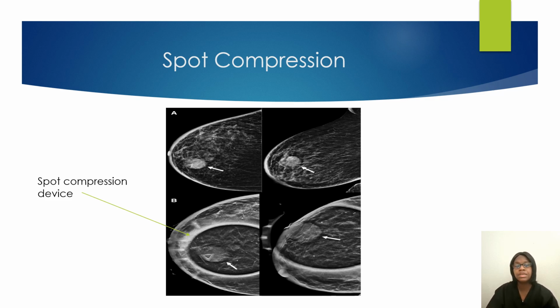Feel free to put in the comment box whether you do diagnostic mammograms or just perform screening mammograms. Depending on whether you're full-time, PRN, or maybe close to retirement, most techs may just do screening mammograms, but I know a lot of full-time techs do diagnostic mammograms. PRNs can do them as well. It just depends on how often you work in mammography and how comfortable you are with talking to the radiologist and doing the spot compression.